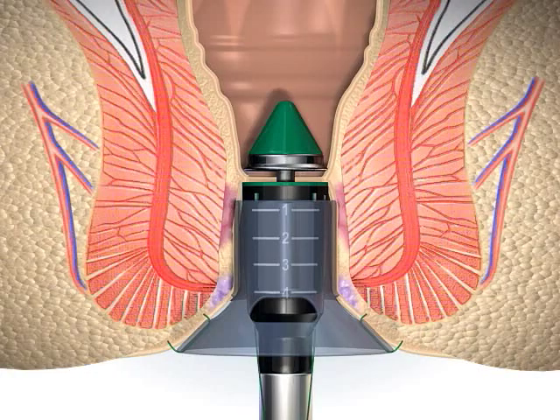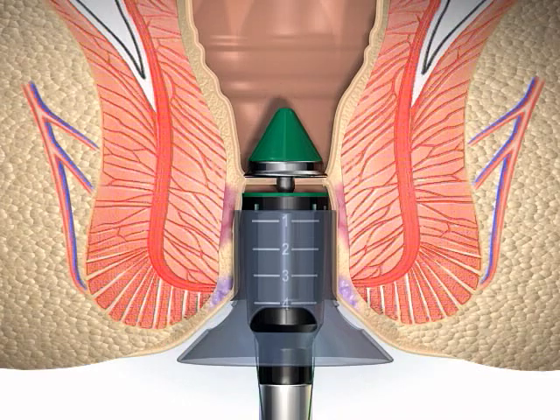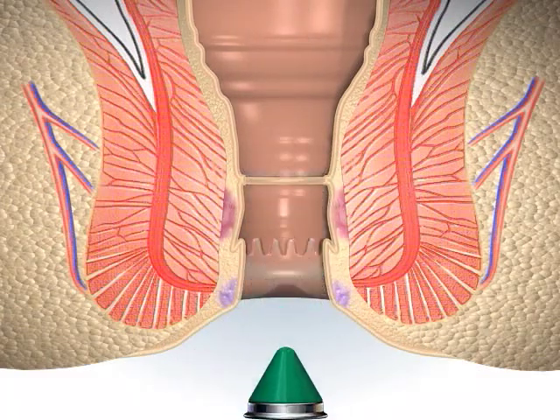Upon extraction, additional turns can cause interposition of mucosa between the anvil head.